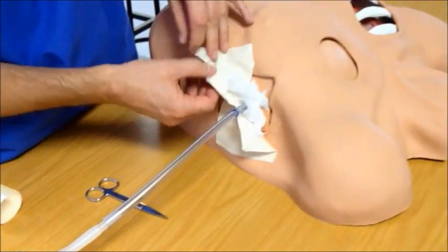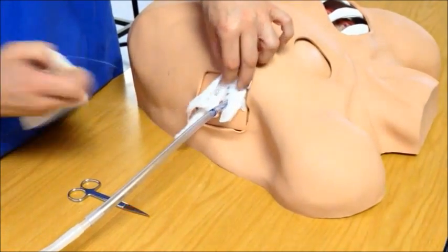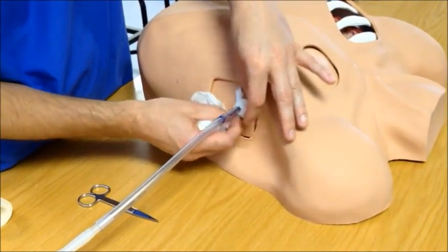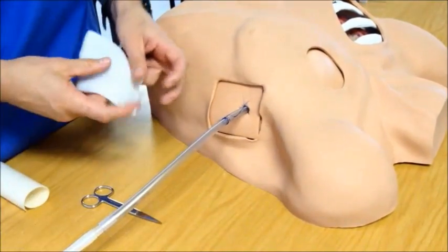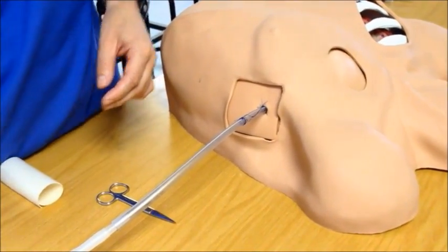Removing the chest drain is relatively simple. First, remove the dressing and remove the gauze around the wound. Inspect the wound and clean it thoroughly before removal of the tube.